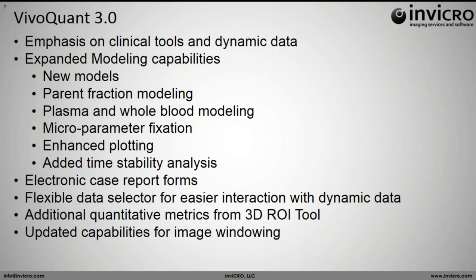We've added a flexible data selector for easier interaction with dynamic data, and we'll go in pretty deeply into how that works. We've added some additional quantitative metrics into the 3D ROI tool, so some more statistically relevant values that you might be interested in.